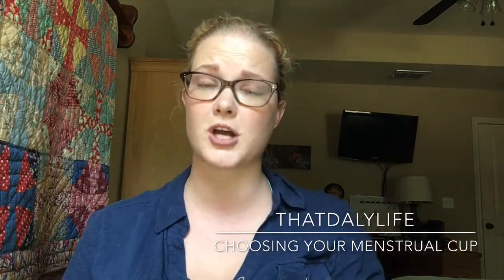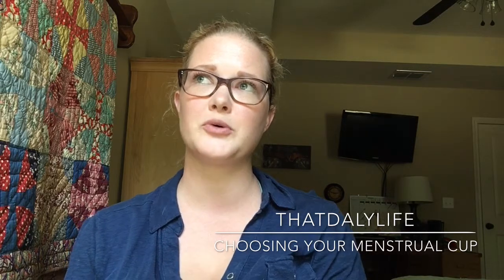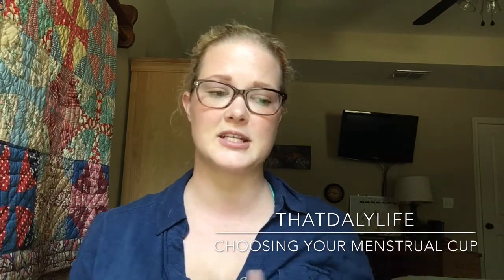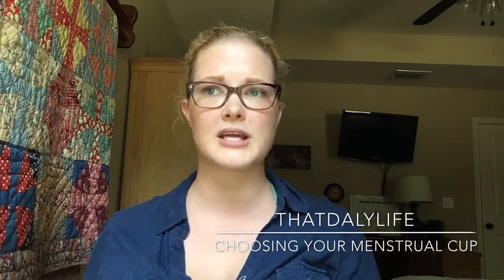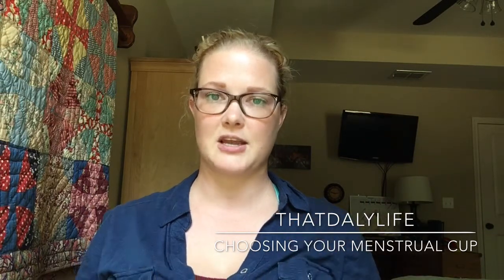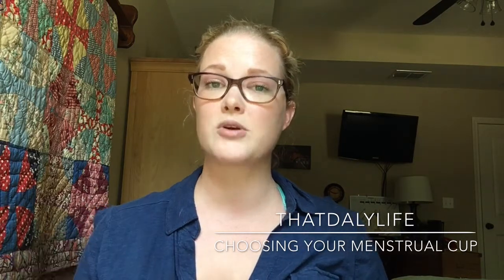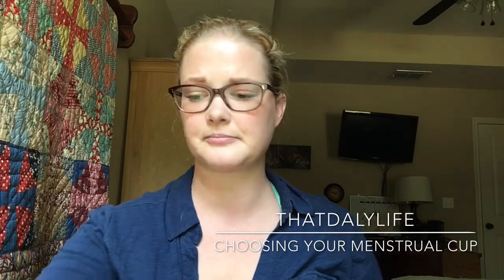I also chose a larger cup because I was thinking, well, a larger cup's going to hold more menstrual fluid, and I go through tampons like nobody's business. My first and second day, I'm using a super tampon every hour, and I was still having leaks, so I totally need a larger cup. Don't go off that. Measure your cervix and then decide what cup you need, because I'm telling you, these things hold way more than you think. Besides that, you're not even bleeding as much as you think you are.